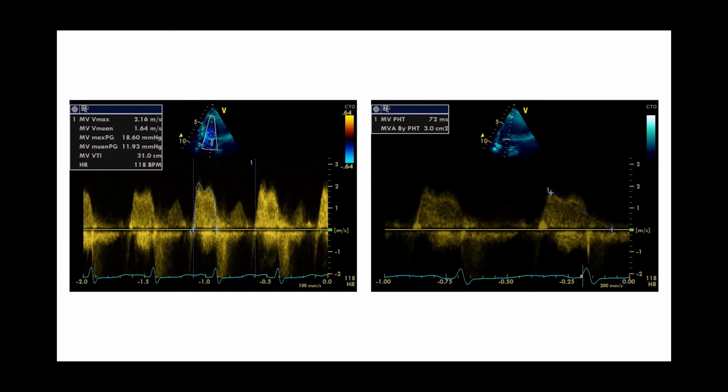So I may need to look at, sorry? Why is that? It depends on the angle, how we have done the Doppler study, which possibly looks different from what I'm seeing on the left side. I'm trying to see whether the angulation looks all right. Always those pitfalls. The only thing is whether there is an aortic regurg there.